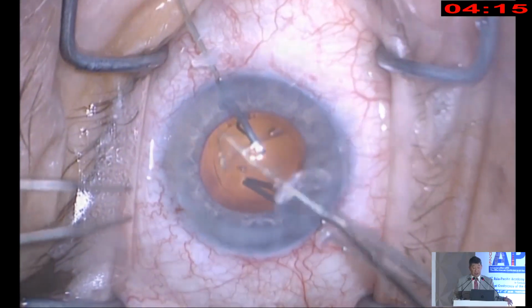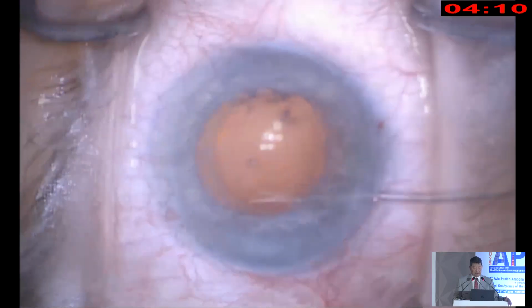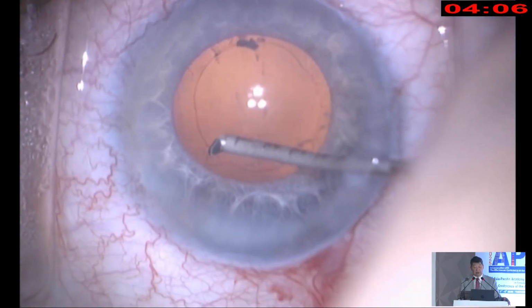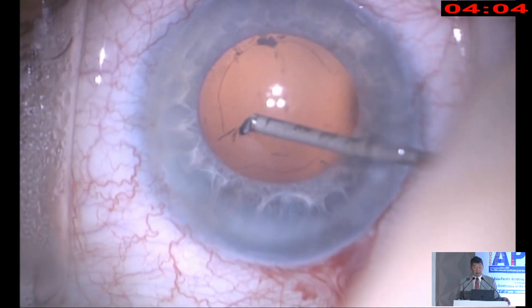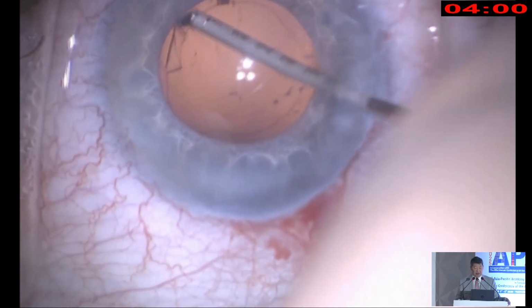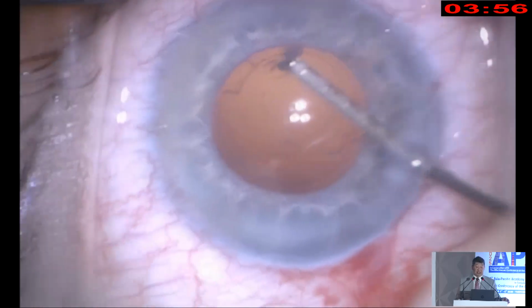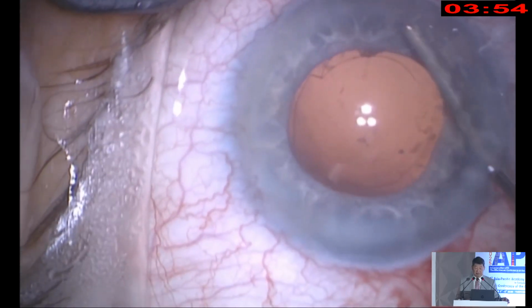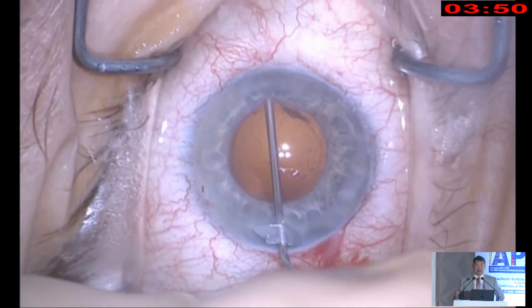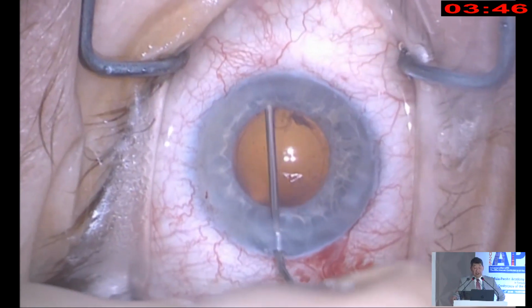Okay. Now, here's another case where there was diffuse zonulopathy. The capsule retractors helped me, and I think this rhexis is a little bit too small. So in order to do this technique, I'm just going to make a secondary little oblique cut and then secondarily enlarge it. These are MST capsule forceps, and they're very controlled, and I love being able to go through a paracentesis site so I don't burp out the viscoelastic, causing the chamber to shallow.